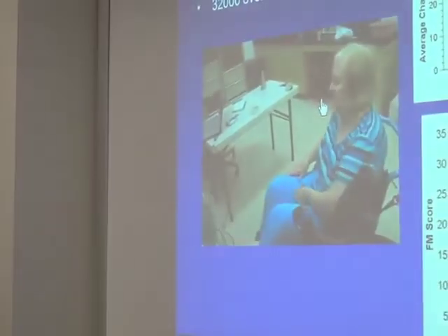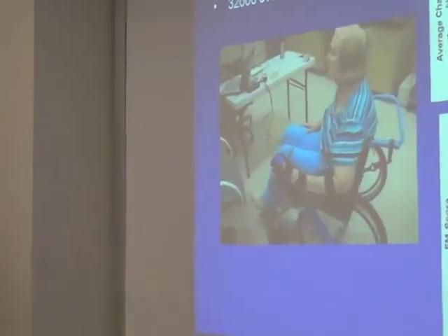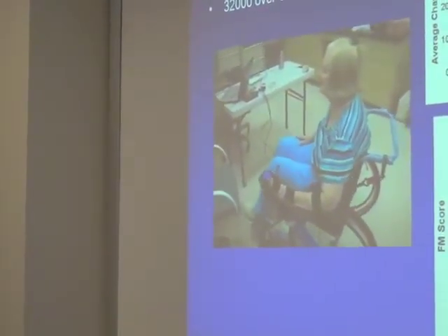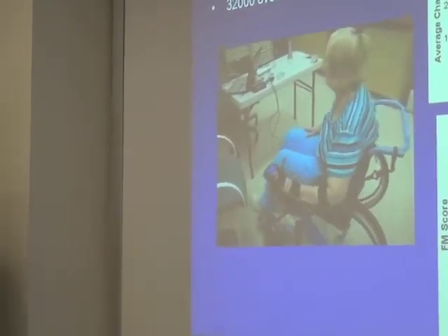So here's the same video. And it just snaps onto your wheelchair and you can rock in it. And we were inspired by conversations with Don Schoendorfer, who's the founder and president of Free Wheelchair Mission. And he developed a low-cost wheelchair that they've given out, I think 300,000 of them around the world, although the need is huge, around, it's like 300 million or something.